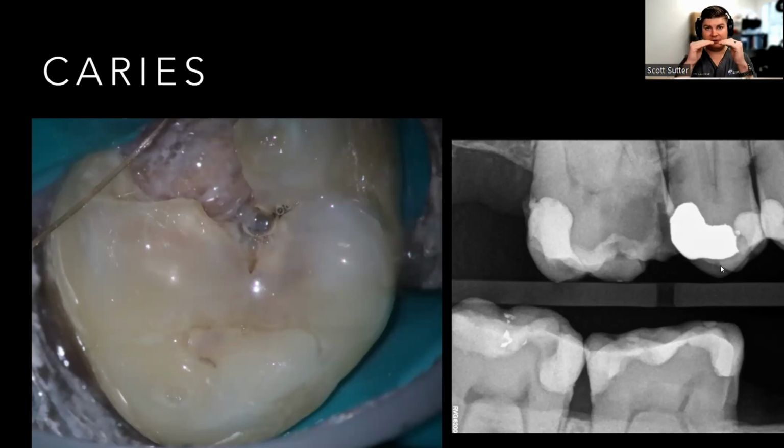So generally, if I flatten off, does everyone understand what happens when you flatten off? You're going to create that right angle there. That's a sharp edge that's going to annoy the crap out of the patient. So what you can do is just take that barrel burr on either side and just flatten it off nicely. Now you can still do this, just use like a big fat diamond. But when you can actually buy your own things, that barrel burr works amazingly well. They also last forever. I think I have to replace them like once a month because they're so beefy. Good question though. Any other questions so far?